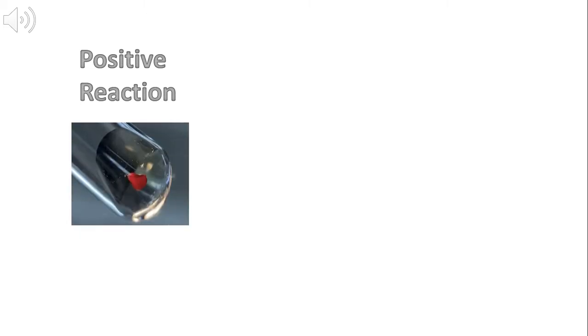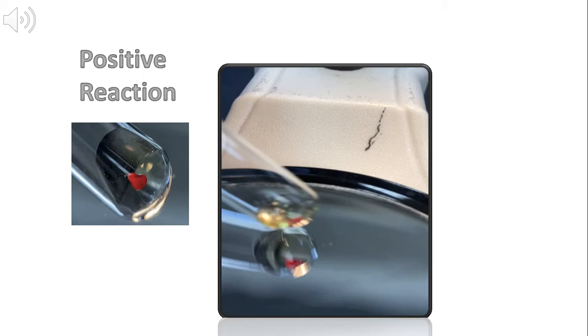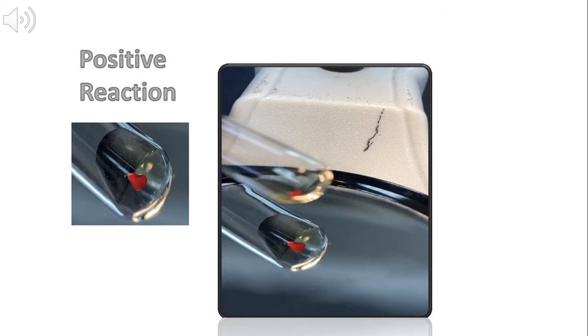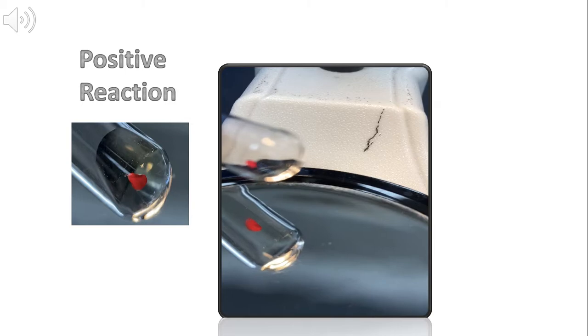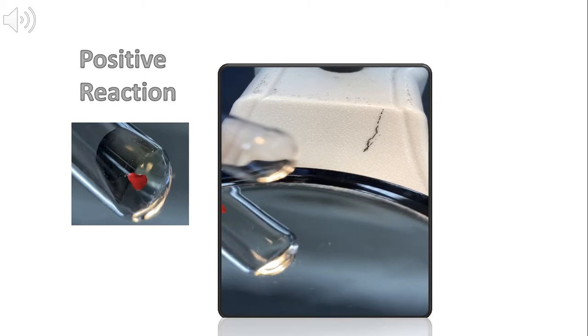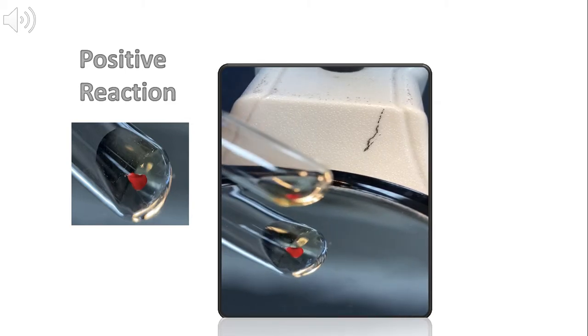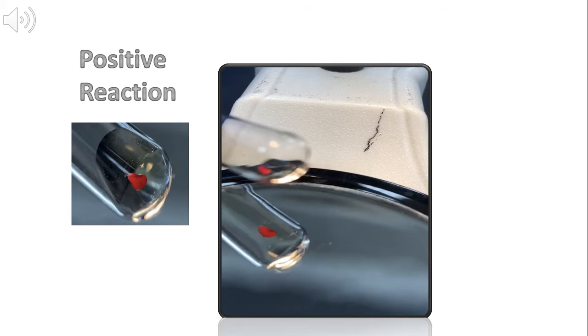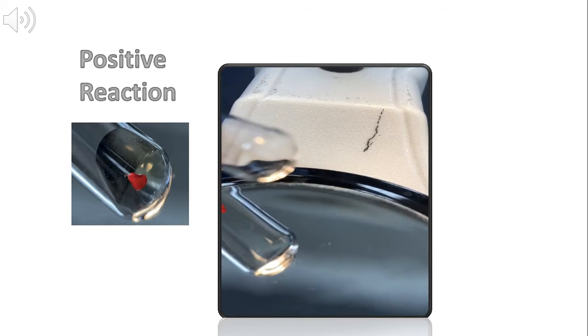To begin our discussion, let's start with a positive reaction. The video in this slide represents a reaction that is considered 4 plus in strength on a scale of 1 to 4. A 4 plus pattern is one in which one solid agglutinate appears behind a clear background.